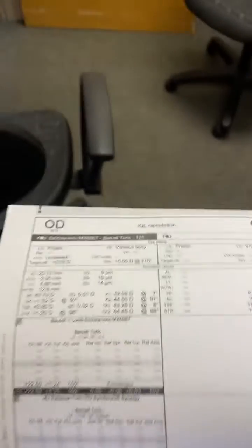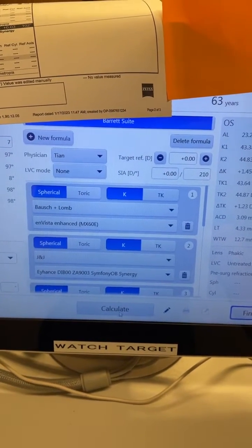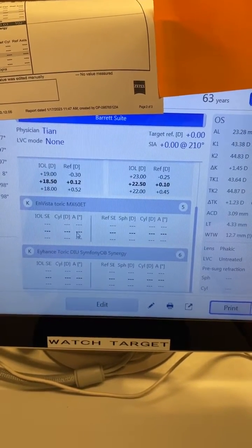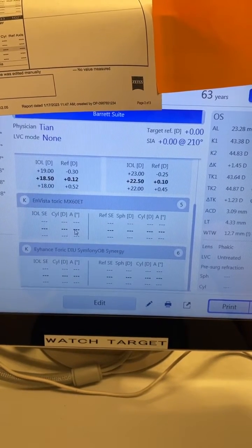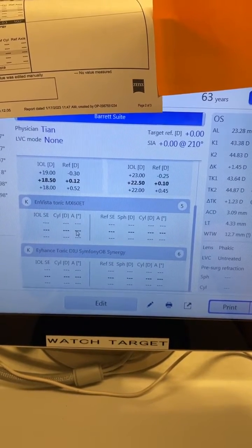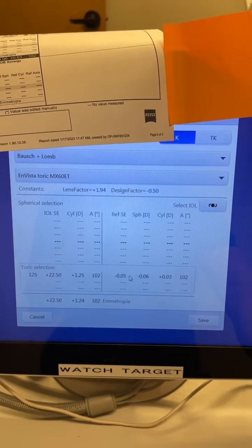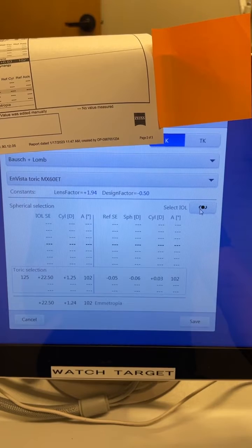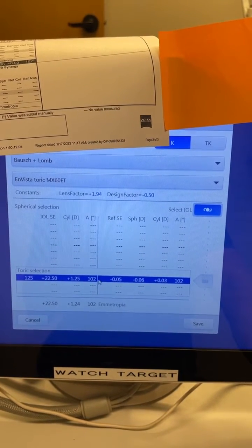The workaround my team figured out is: after you calculate, it'll show you nothing — no options in the toric section — but you can click the three checked lines. That will lead you to a new screen, and then you can click the IOL symbol, and it'll highlight that for you.